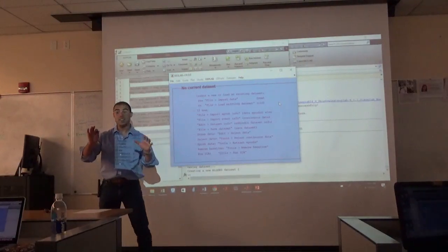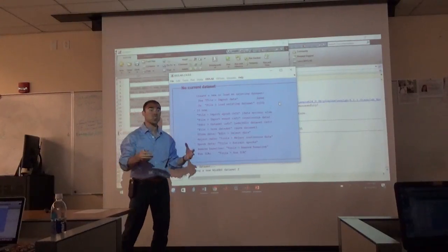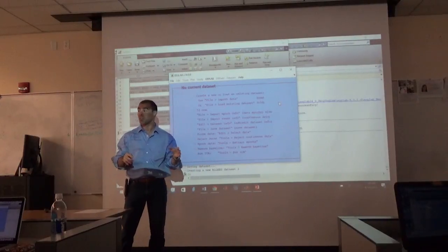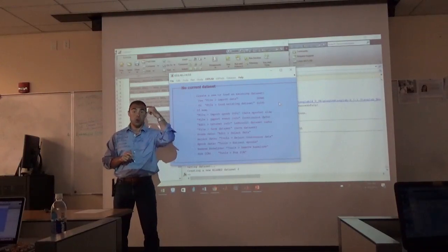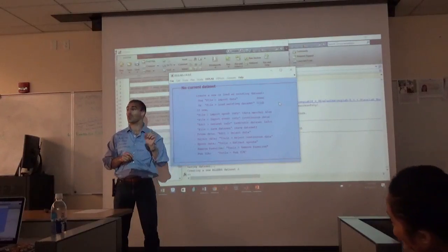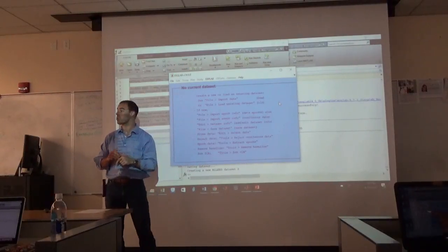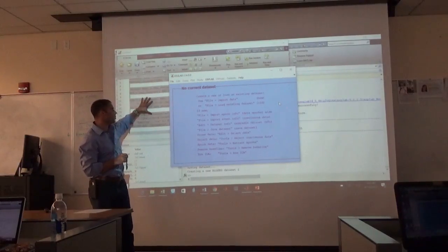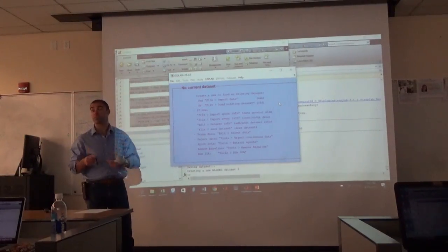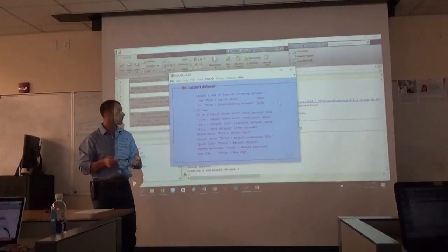So, we're not going to get into the programming just yet, because we have our hands full. But I wanted to foreshadow a little bit for you guys, to let you know that there are really simple ways that we can zip this through. But in order for that to work, we need to know in our minds what the steps are that we have to do and why we're doing them. You know what I'm saying? So that's why we're going to go through it by hand, so that we understand what we have to do. We'll do it for one or two subjects, and then you can zip through all the rest of the subjects. It's called batch scripting. Sound pretty cool? Okay, cool.